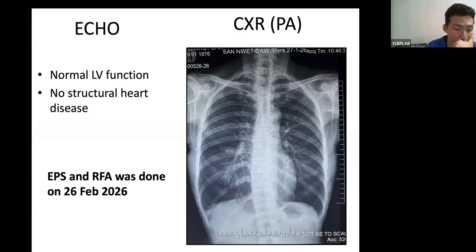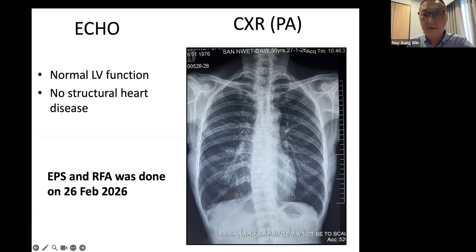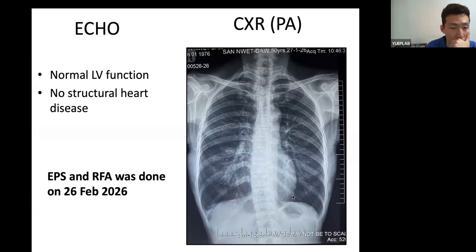What do you think of this heart? Is this heart a normal shape? No, a tubular heart. What else? Where's the apex in this patient? The patient has a slightly rotated heart also. Okay, half dextrocardia almost. That's why you don't see the apex.